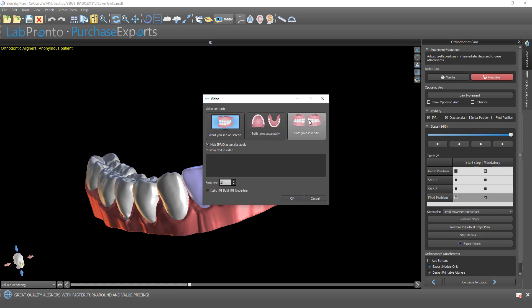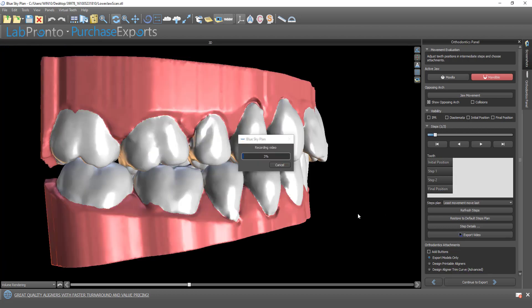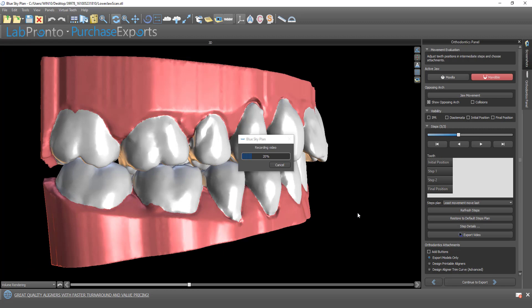Let's say we choose both jaws in a bite. We have the option of hiding or showing the IPRs and the attachment values in the video. And we could add text, whether it's the dentist name, lab name, or unique patient identifier. Let's just put in Sky Orthodontics. You could change the font size a little bit and some options here and click on OK.